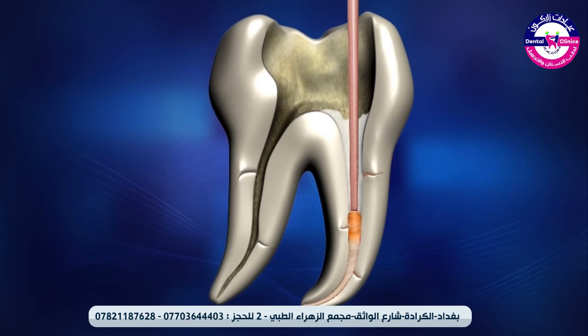Do not attempt to backfill the entire canal in one shot. After the extruded material fills the backfill space, the back pressure of the extruded gutta percha will move the tip back out of the canal. Slowly withdraw the gun tip from the canal. Take your time. After withdrawing Dia Gun's tip, use the hand plugger to pack the filled gutta percha material.